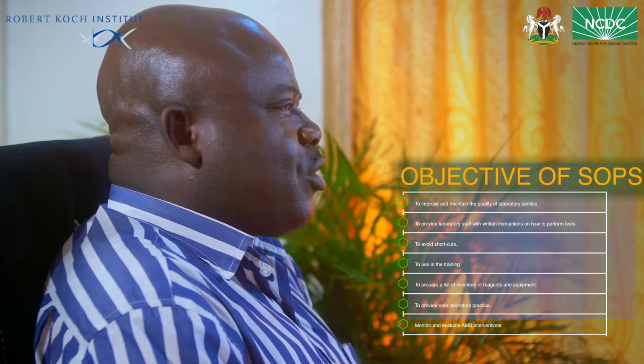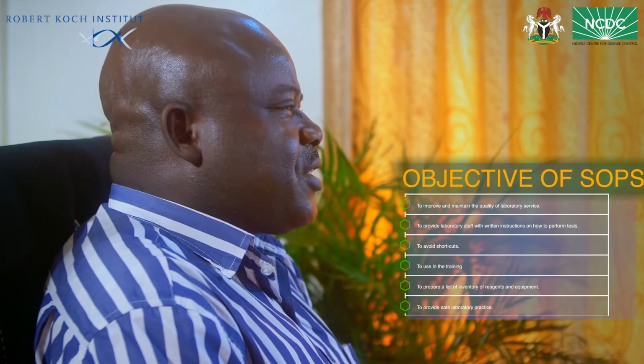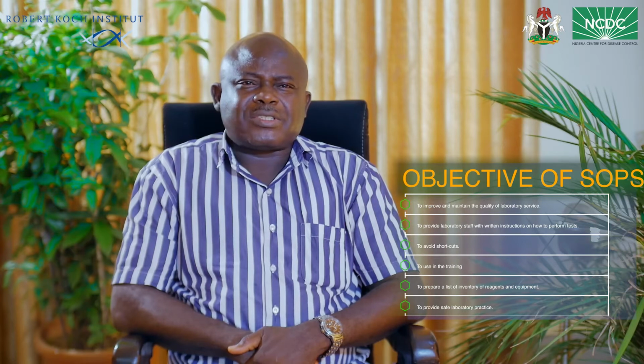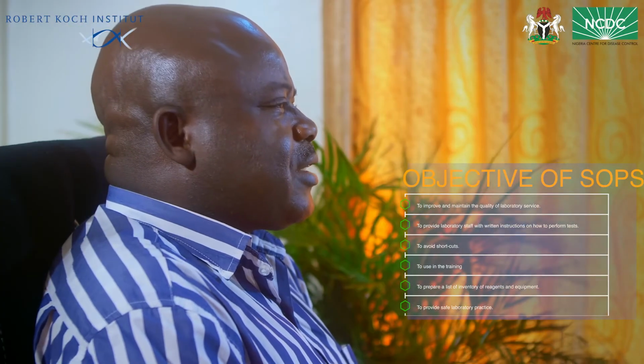The objective of an SOP is to improve and maintain the quality of laboratory services, to provide laboratory staff with written instructions on how to perform tests, to avoid shortcuts, to prepare a list of the inventory of reagents in stock and also the equipment, and to provide safe laboratory practice.